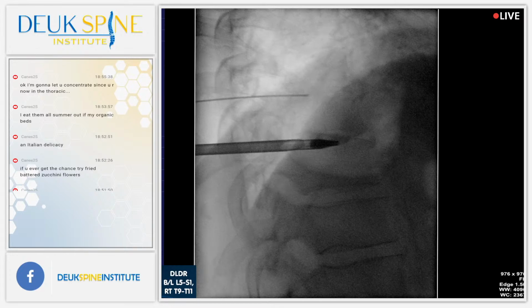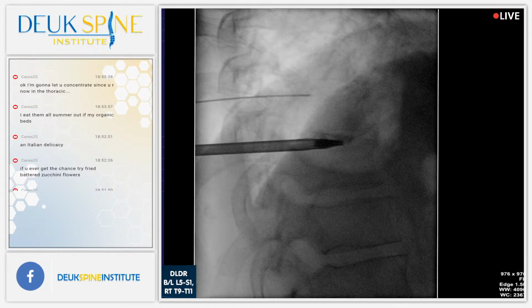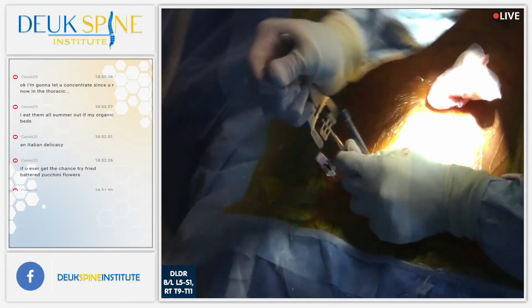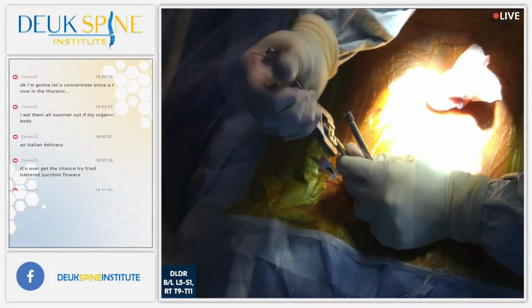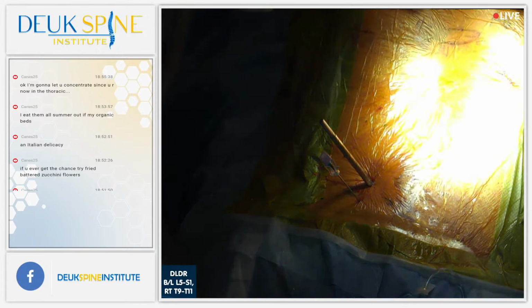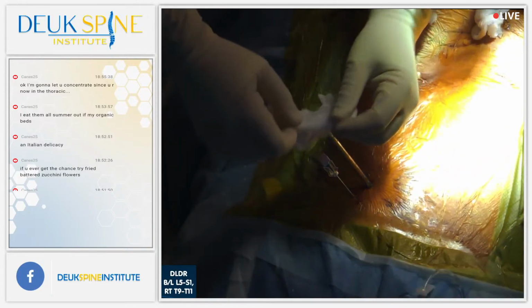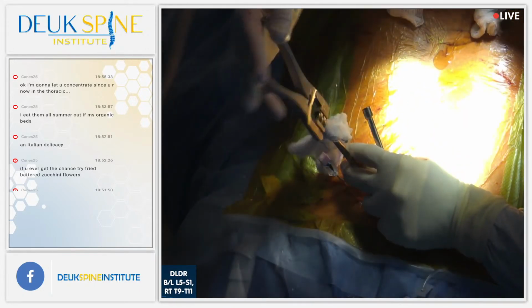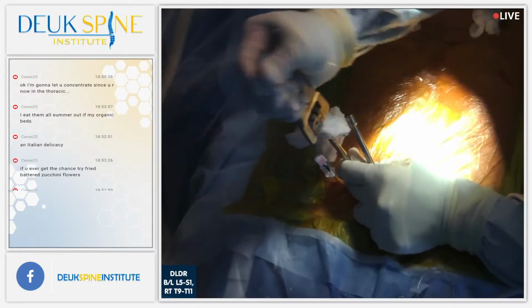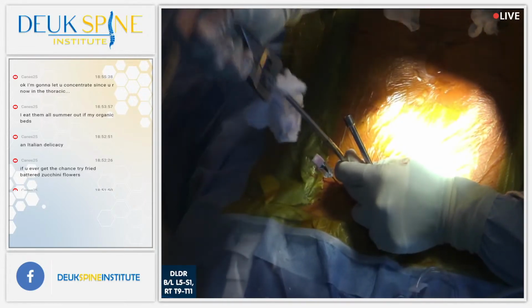Now the tube is going in. How is he? Stable? I think that is probably as good as we can do, right? All right. So now we have a tube in the disc. Just give us a minute while we work. We've basically cold welded the dilator and the tube together by getting some herniated disc in between the two of them. Good. Luis, nice job. Luis is the man once again.